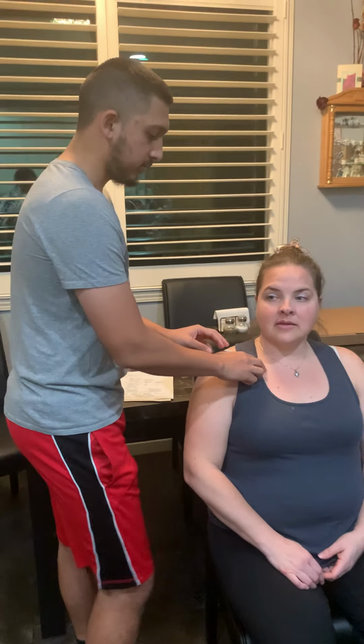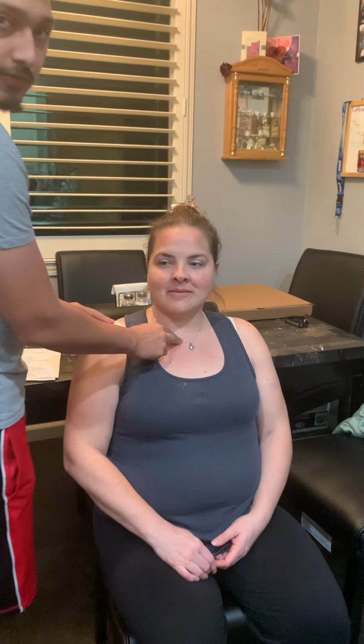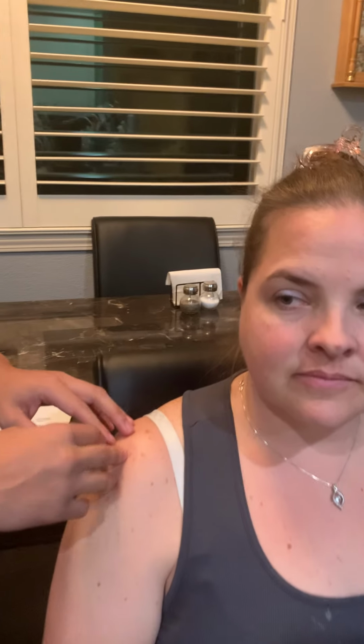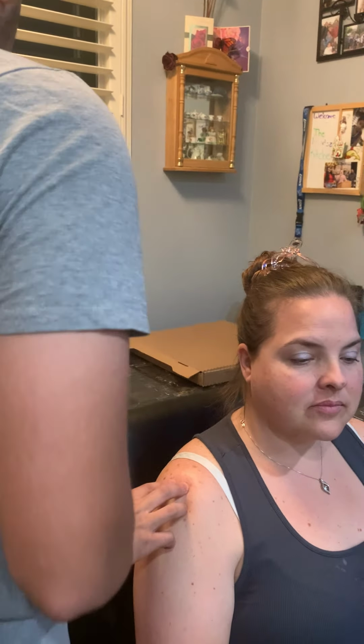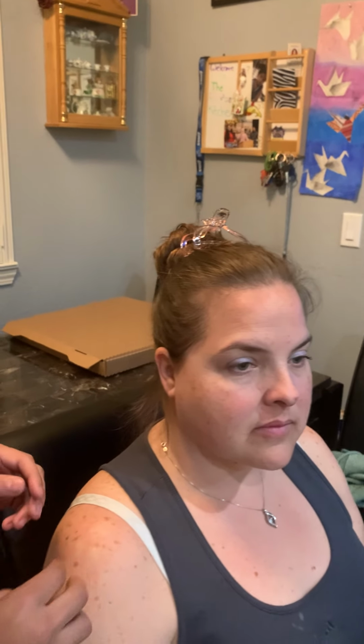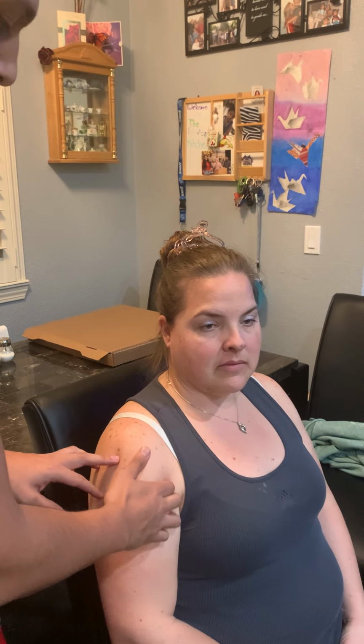The clavicle right here, the sternoclavicular joint, which is right here, connects the sternum and clavicle together, and then the acromioclavicular joint, which connects the acromion and the clavicle, and then we check for the humerus head, which is right here, the humerus, and then the bicipital groove, which is right here.